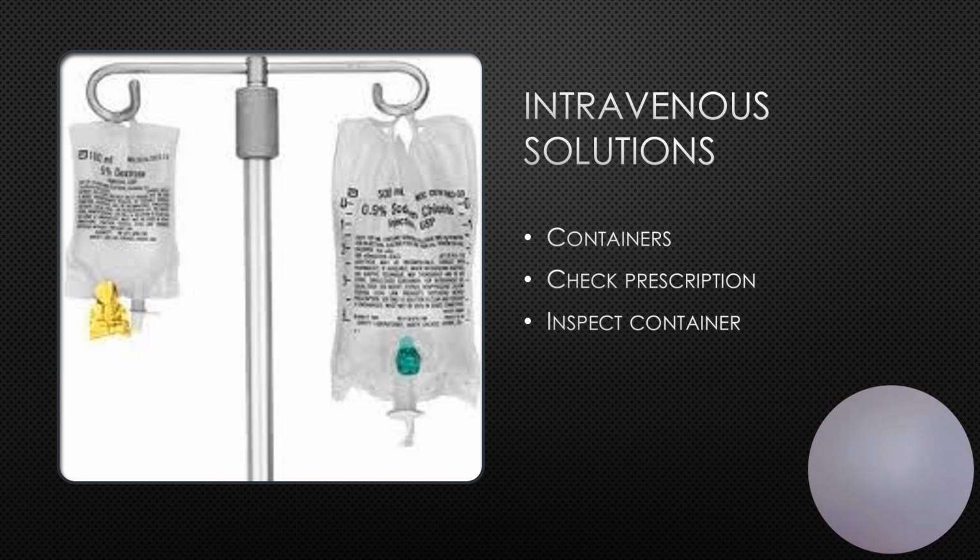Always inspect the solution container to determine if there are any free or floating particles. It's not discolored, it's not expired, it's not cracked or leaking. And if issues are discovered, do not use it. Return it to the pharmacy. The pharmacy may receive a credit from the vendor, and we definitely will not charge the client for that damaged bag.